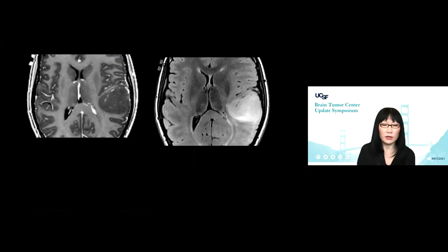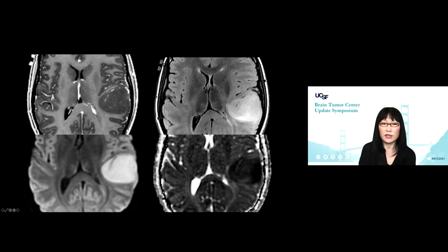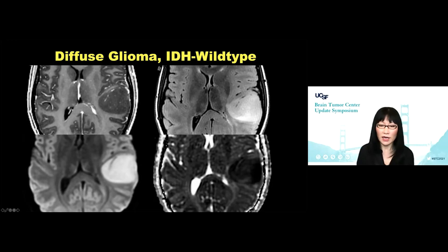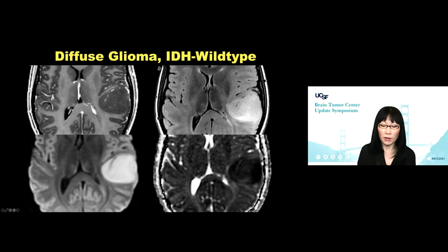How about this young lady? She was thought to have a stroke because DWI and ADC maps showed very homogeneously reduced diffusion. But in fact, this is a diffuse glioma IDH wild type. And whenever we see a non-enhancing mass that looks like glioma, we go and look for DWI and ADC map. If indeed this non-enhancing mass is reduced, this is a telltale sign of most likely a highly aggressive malignant glioma.